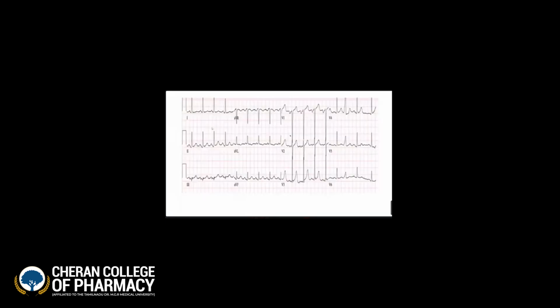Okay. One more last one. How about this ECG? Is AVR negative or positive? Negative. Is the rhythm regular or irregular? I guess only 2 to 3 students are interactive. I can't see any students interacting. Okay, regular. Here it is regular rhythm.